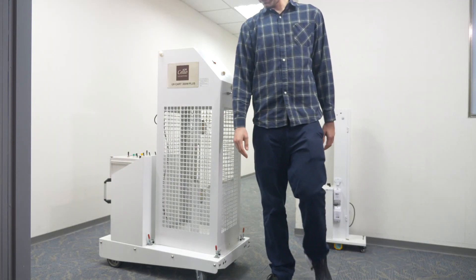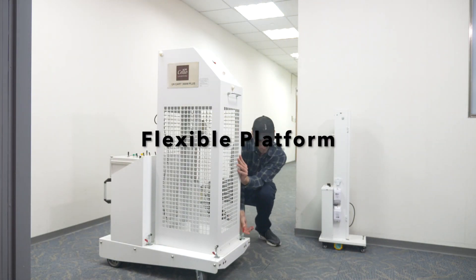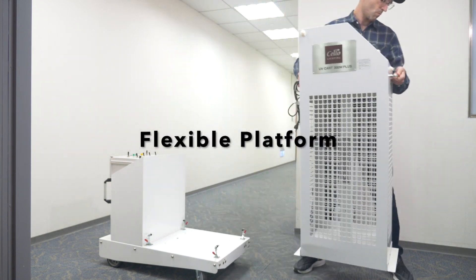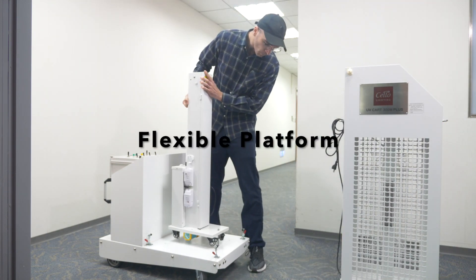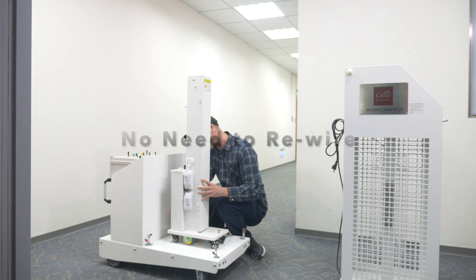Cello UVC robot is a flexible platform which can work with existing Cello UVC lights. Once integrated, the Cello UVC robot and lights can work as one machine without any need of rewiring.